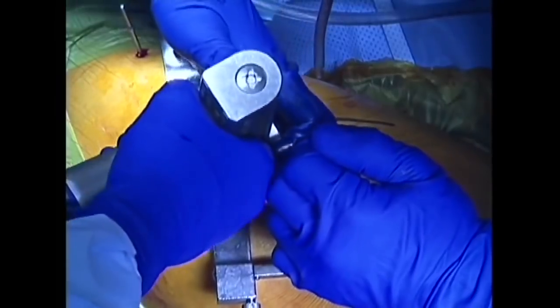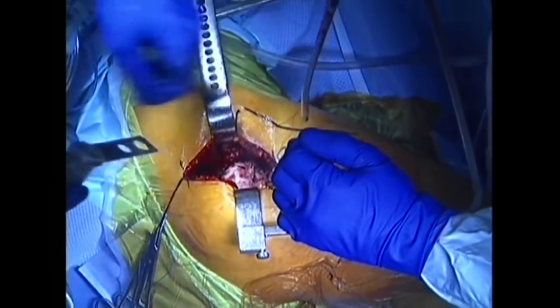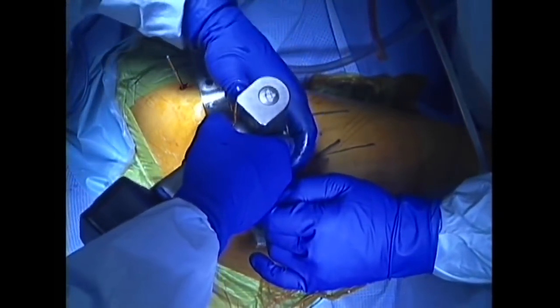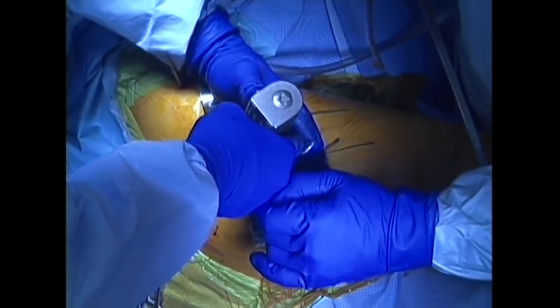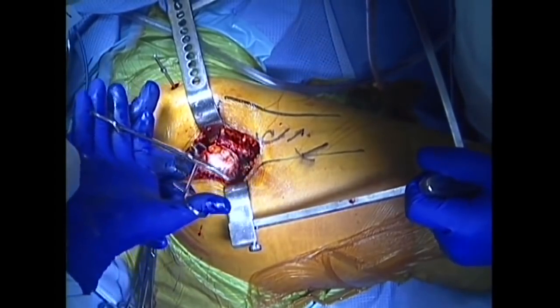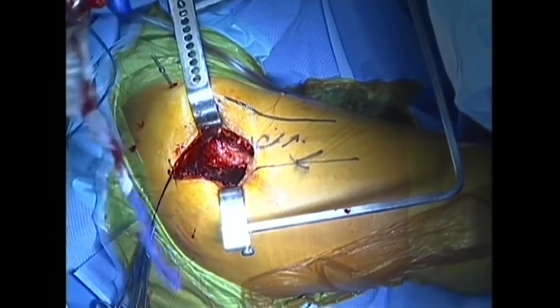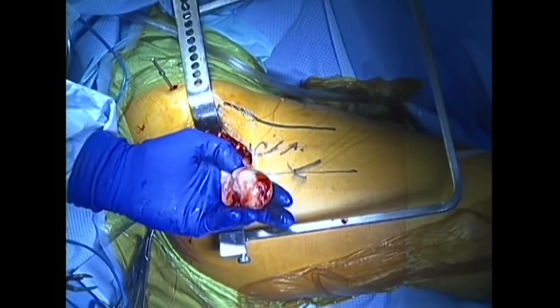A line is drawn where the head and neck of the femur will be cut, and a power saw is used to make the cut. The painful arthritic ball is now removed. Inspection of the femoral head reveals cartilage loss, spurring, and deformity seen in hip arthritis.